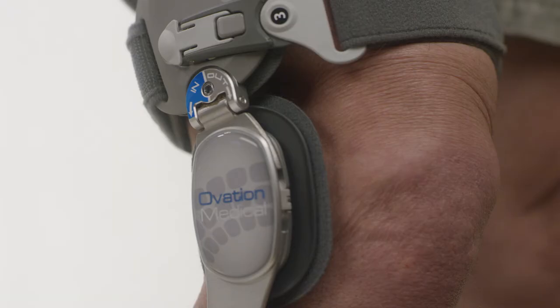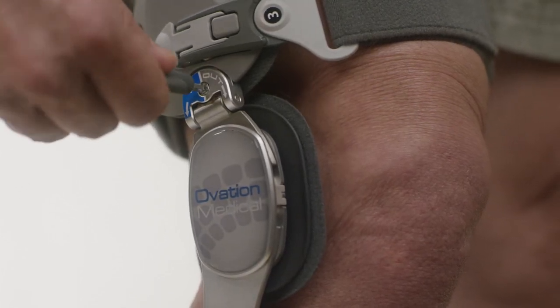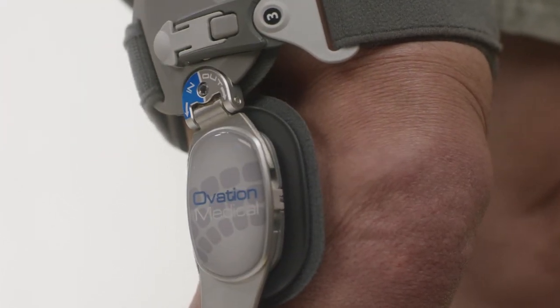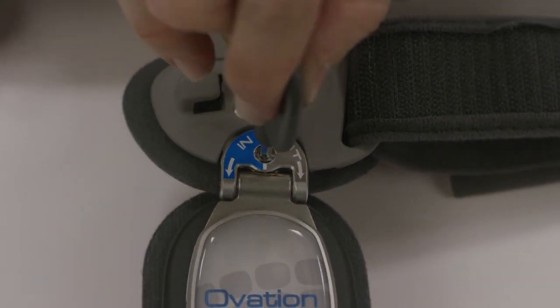Step 5: Varus valgus adjustment. For varus relief, turn the key in. For valgus relief, turn the key out.